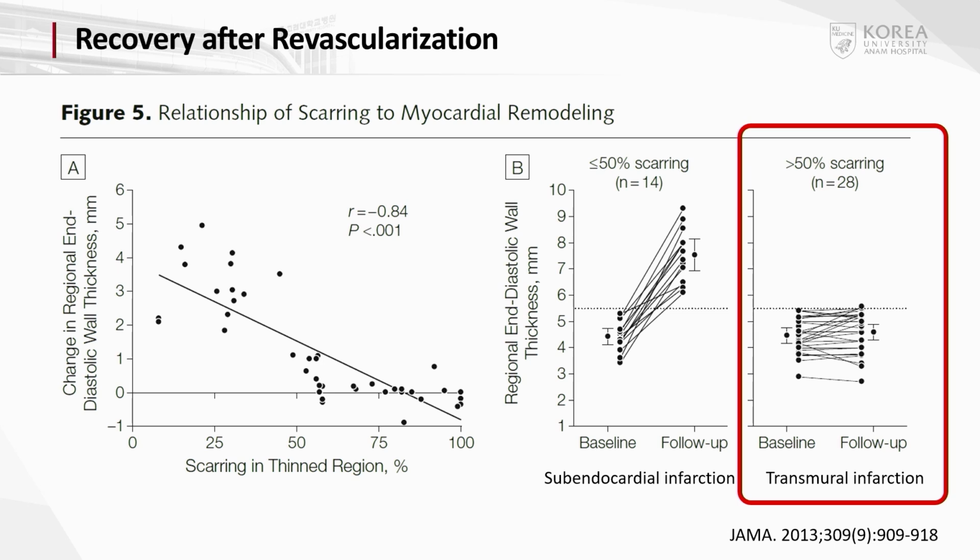The extent of infarction correlates well with the likelihood of functional recovery after revascularization. So, subendocardial infarction may show wall thickening after treatment. However, transmural infarcts do not recover regardless of revascularization.